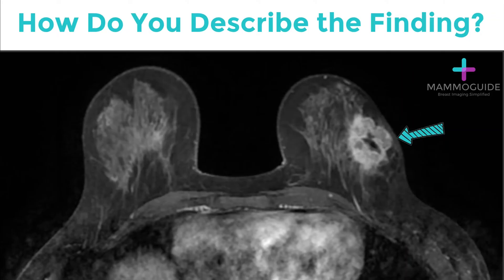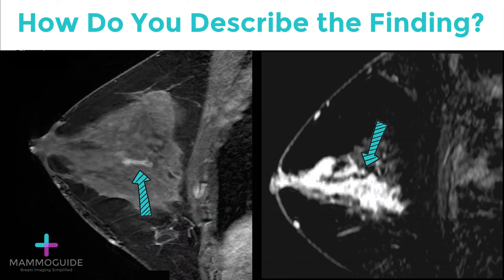How would you describe this finding in the left breast? Is it a mass or non-mass enhancement? Because this has defined borders, this enhancing lesion is a mass. How about these abnormalities in the right breast?